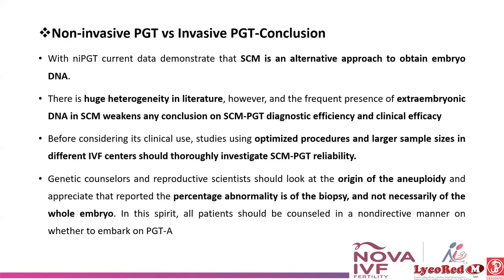Right now, some of the centers don't have their own biopsy practitioner, or they don't have laser machines, or because it costs a lot, they are not doing PGT at this moment. We know that in some particular cases PGT is a must, but they are not able to do it because of this limitation. So they can do PGT with the help of non-invasive PGT.